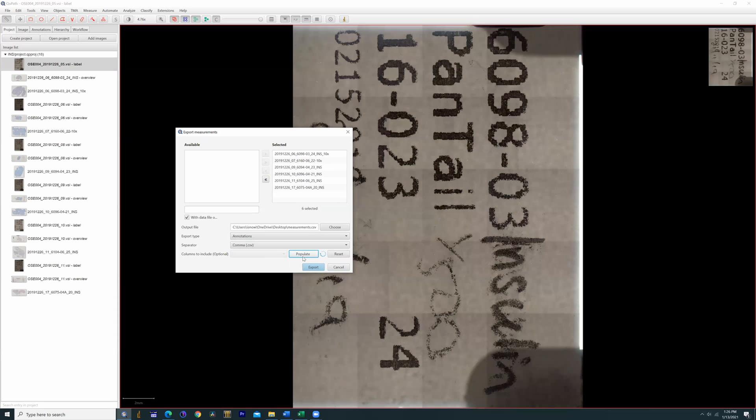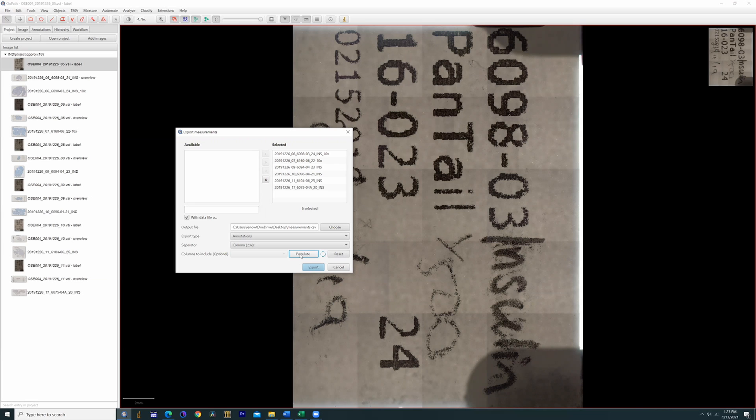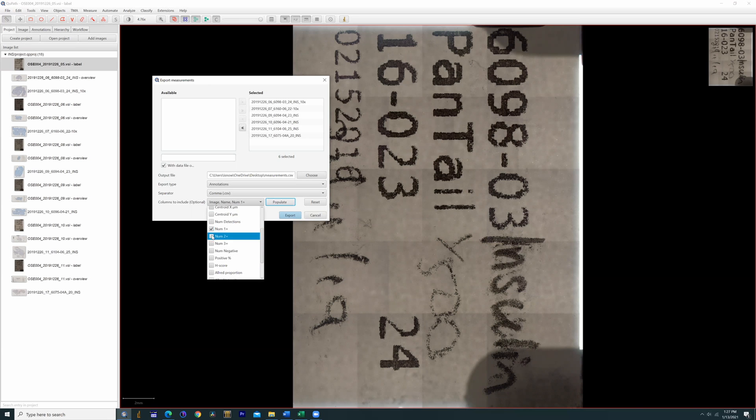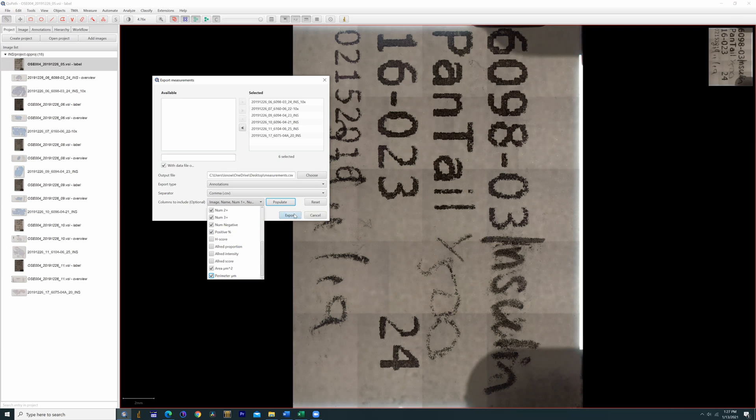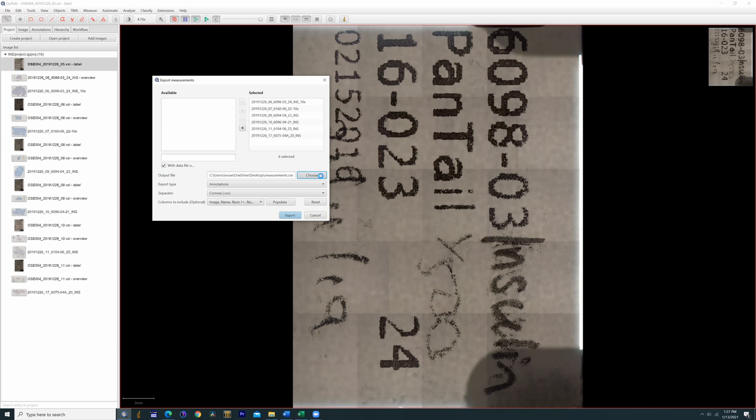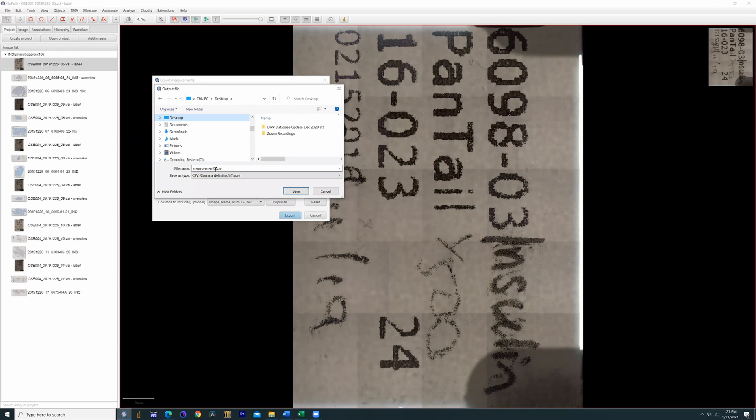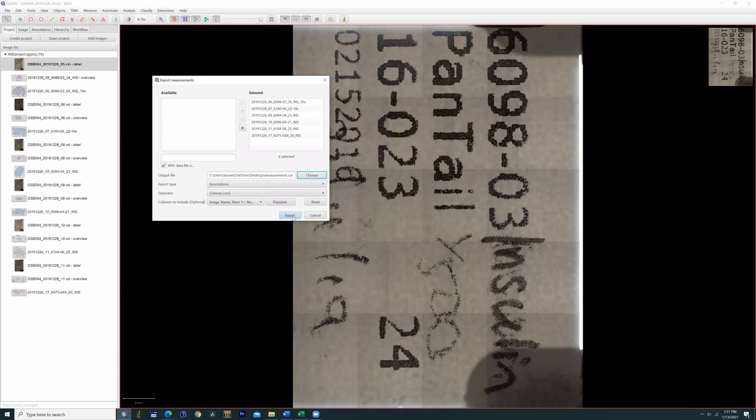If you don't do this, it will give you all the data generated by default. You can actually go into this, it takes a second here, and click out the columns of information you actually want to export into the file. Here, one sec. It may take a minute. And so now you can see there's the image name, the names, the images. In this case, say I want the different detection ranges, positive, surface area, the parameter, whatever. Anyway, so we click on the choices we want and we say, of course we have to specify a location. So here you can put in a name and location anywhere on your hard drive. In this case, I'll put on my desktop, just make it easy to find. Desktop. And then we'll say measurements, save and hit export.